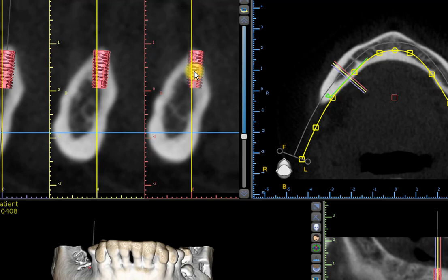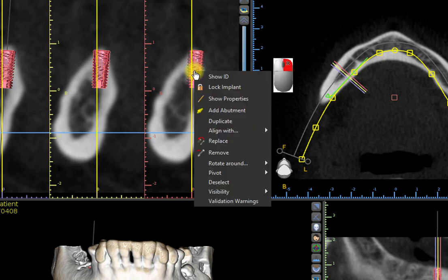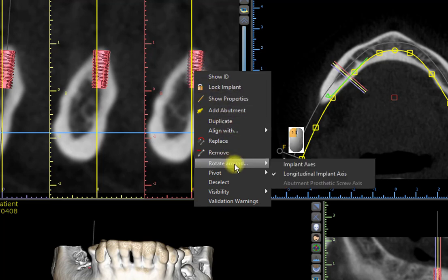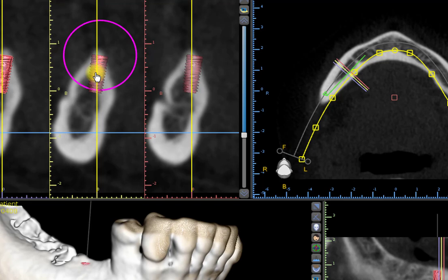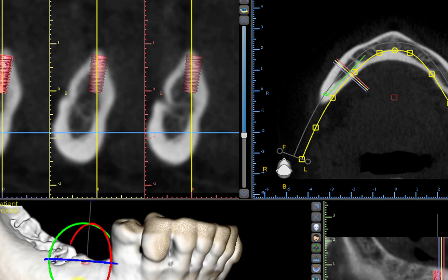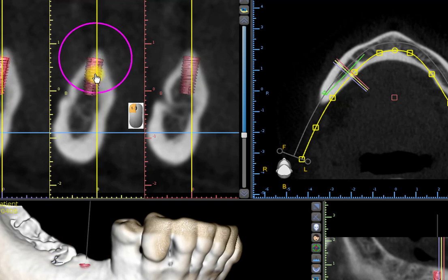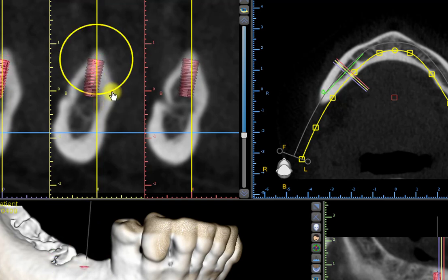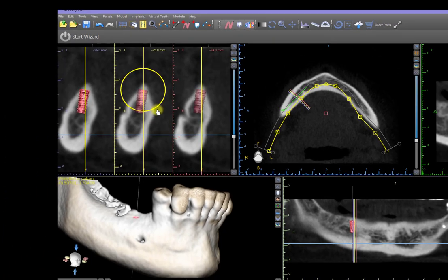If the implant still cannot move, right click on the implant once more. From the pop-up menu, click Rotate Around, and from the sub-menu, click Implant Axes. You can now see the widgets in the 2D or 3D images, and you'll be able to left-drag on the implant to move it, or left-drag on the circular widgets in order to tilt.